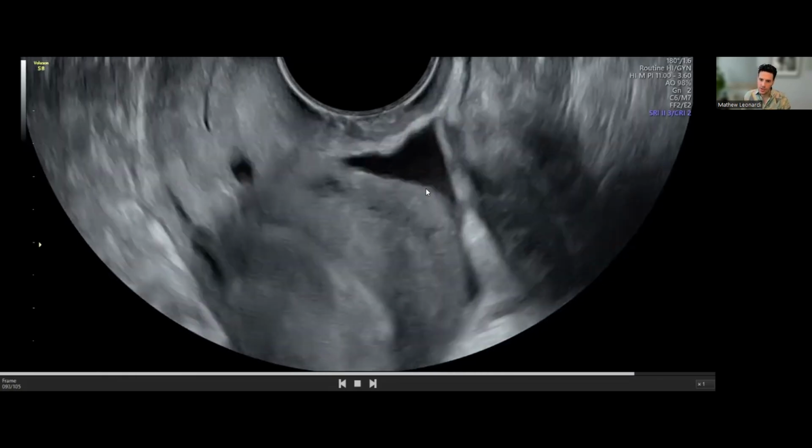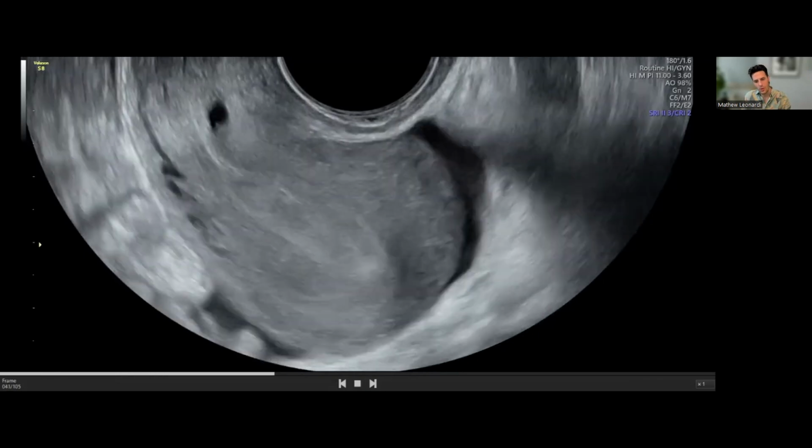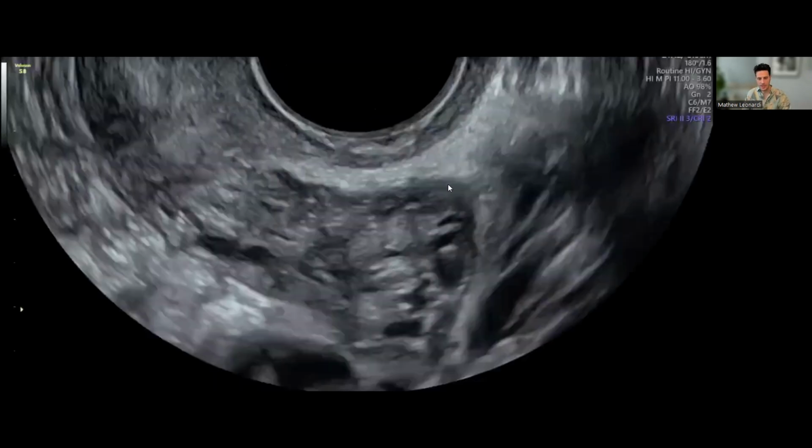Is there anything else in this clip? Is there any other superficial endo? Not a whole lot else jumping out at me, so I'll move on to the next clip.